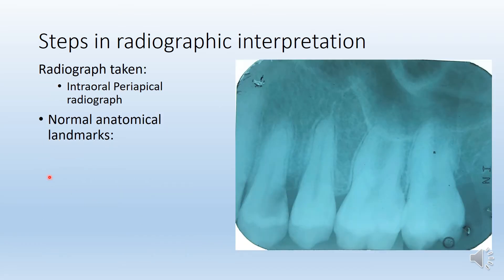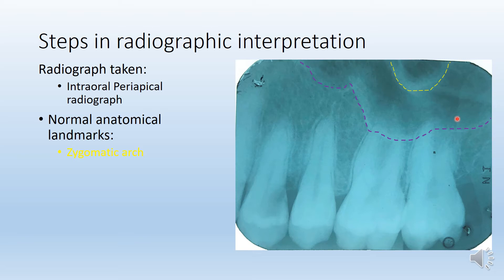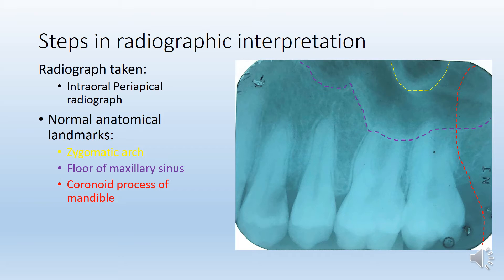Let's look at this radiograph. First of all, we need to analyze that it is an intraoral periapical radiograph and from the appearance, it looks like it is the second quadrant. The normal anatomical landmarks seen here are: the yellow line which is your zygomatic arch, the purple line which is the floor of the maxillary sinus, and another shadow in the posterior part which is the coronoid process of the mandible — visible on most posterior maxillary molar radiographs.